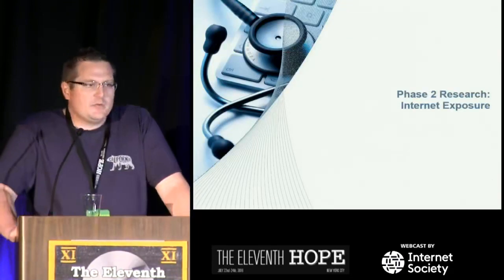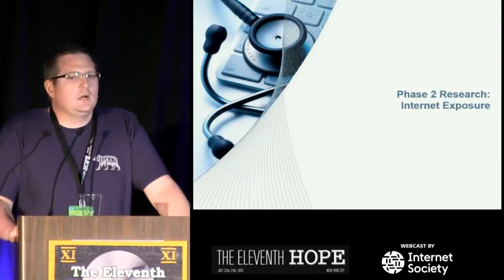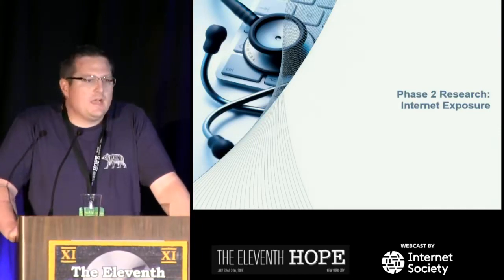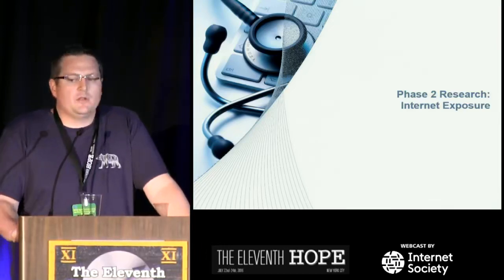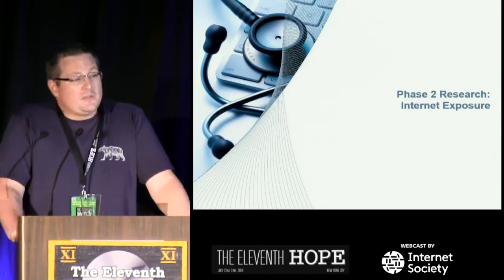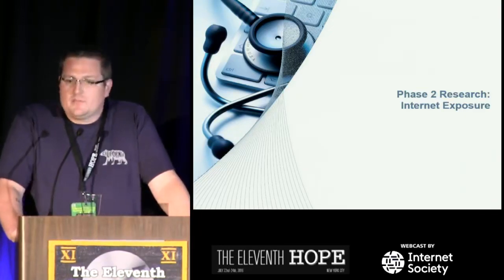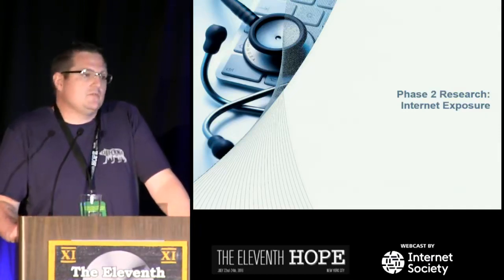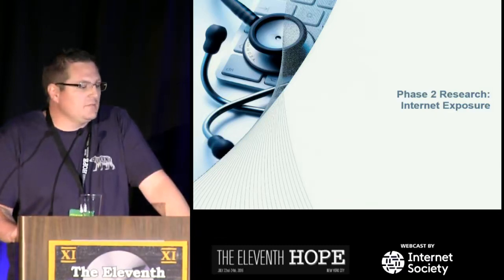After we finished that research, we said, okay, these devices are definitely vulnerable. But what's the real risk of an attacker being able to get to them? Are they going to have physical access? Are they going to have to send a phishing email in? Or are they directly connected to the internet? Or are there hospitals that have misconfigurations exposing vulnerabilities in other systems that give direct access into the internal network and to the internal connected medical devices?